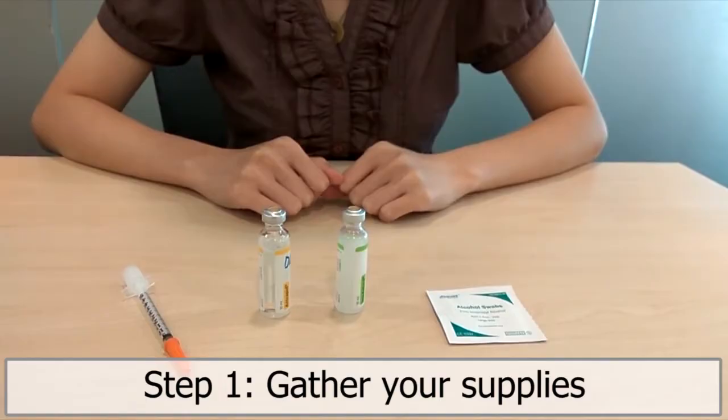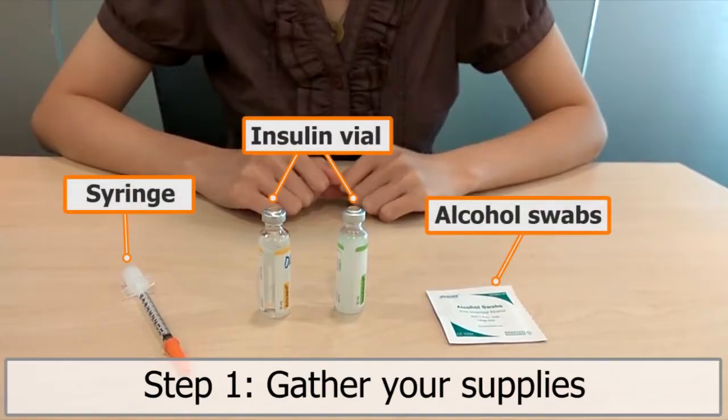Step 1. Gather your supplies: insulin vial, syringe, and alcohol swabs.